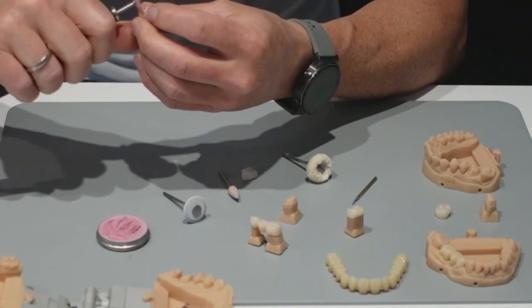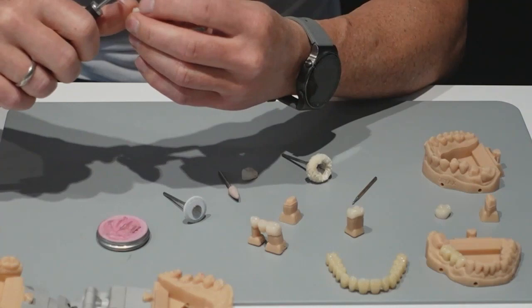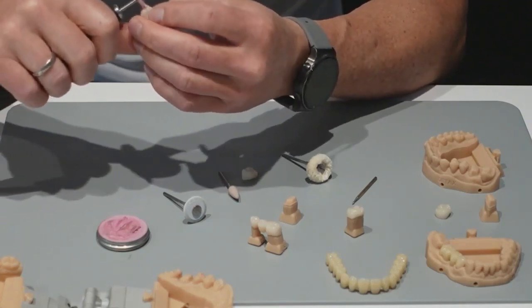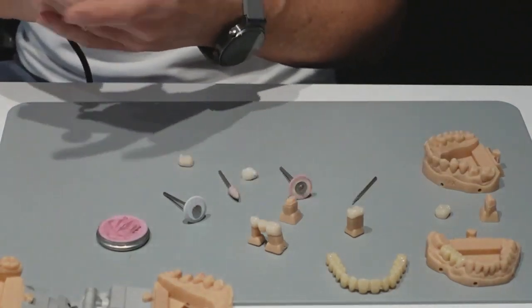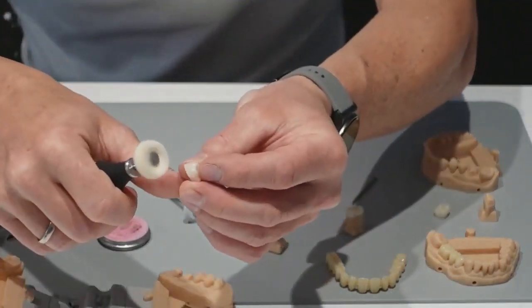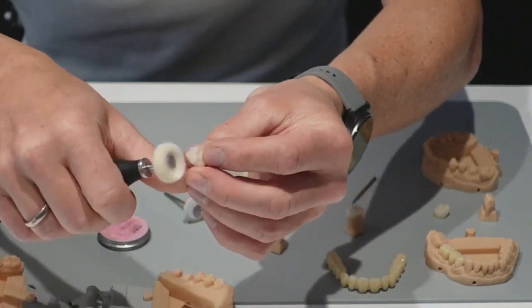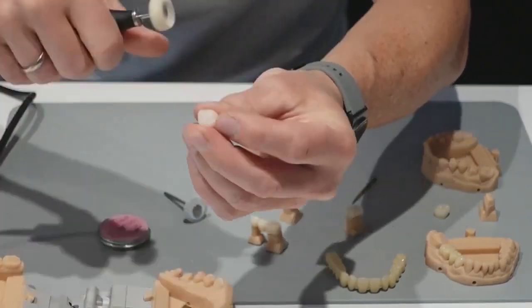Okay. So you do not need so much time to make a shiny surface. For the last step, you use a cotton lens, and now you can see the shine comes directly. I hope you can see that.